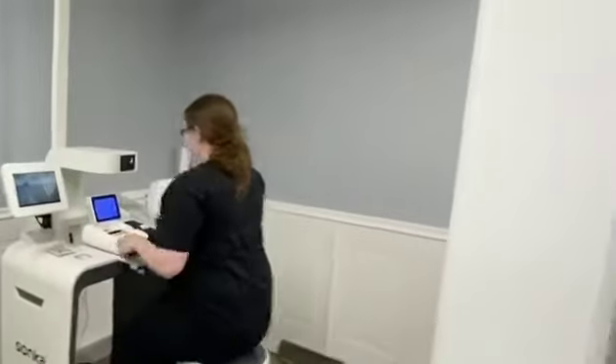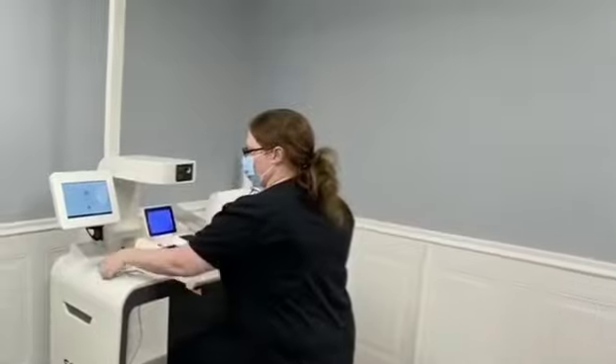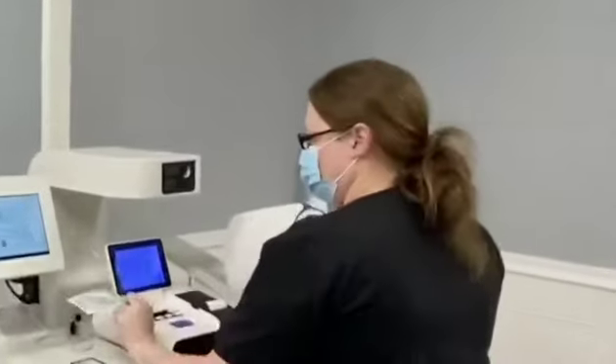The automatic blood pressure machine is going to work. Please scan your barcode or QR code.